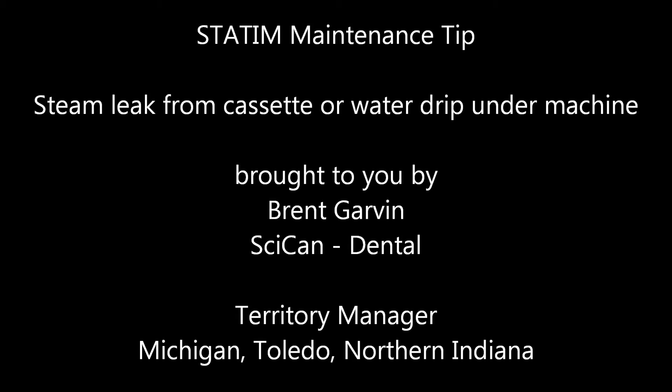Hello, Brent Garvin with SciCan Dental here with a helpful STATIM maintenance tip. Is your STATIM cassette leaking steam, or is there water pooling underneath the machine? Then follow these four easy steps before contacting your local dental supplier for service.